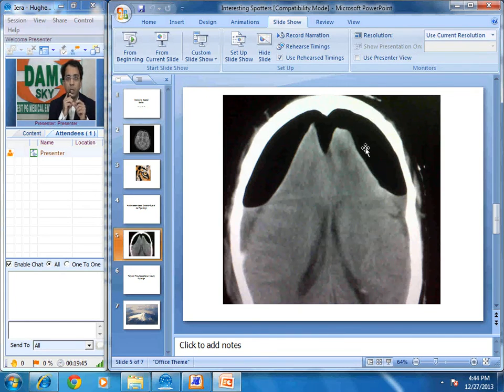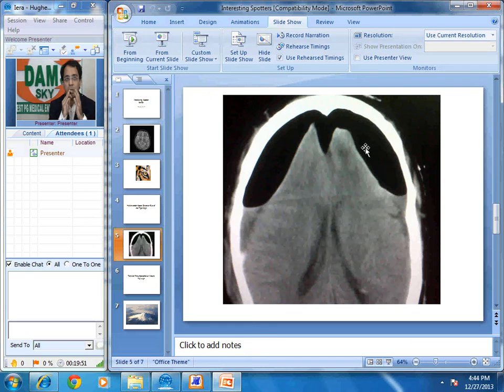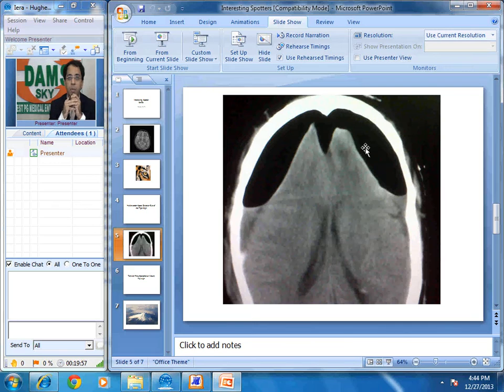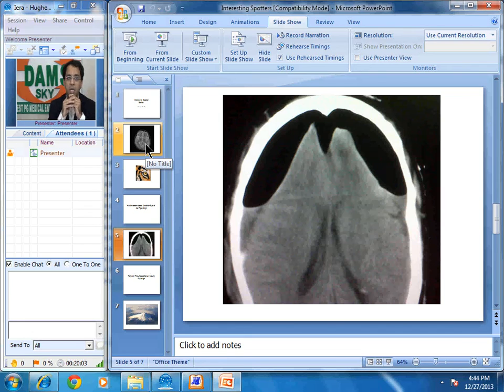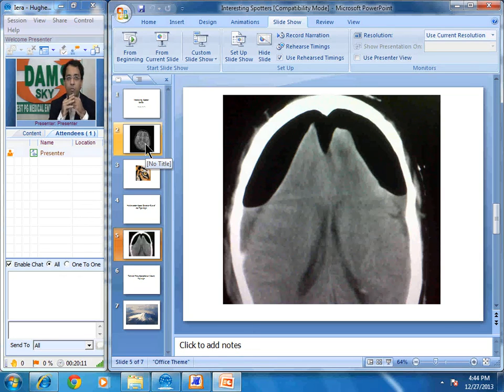Had it been non-tension pneumocephalus, the surface tension causing the two hemispheres to stay together would not have generated enough pressure to displace and widen the interhemispheric fissure. So this is called the Mount Fuji sign. These are two interesting neuroradiological signs now being asked in exams and to MD residents as spotters — one is the Mount Fuji sign, the other is the Eye of the Tiger appearance.